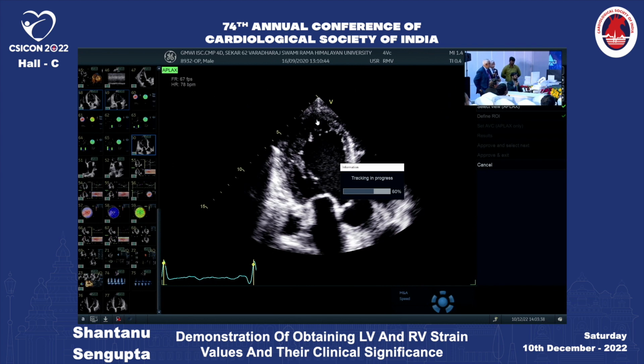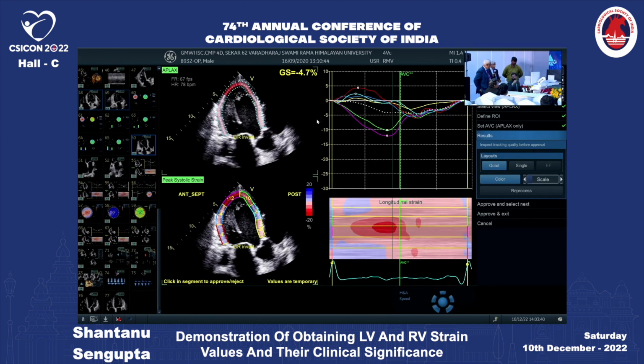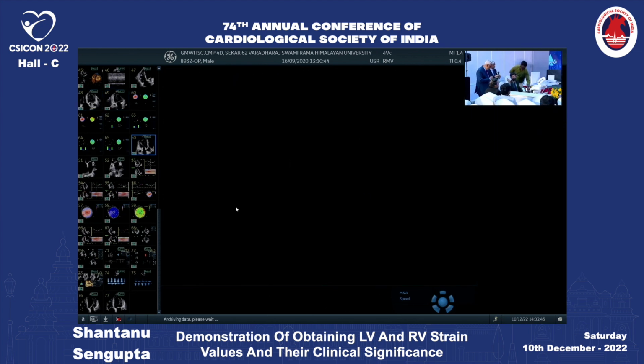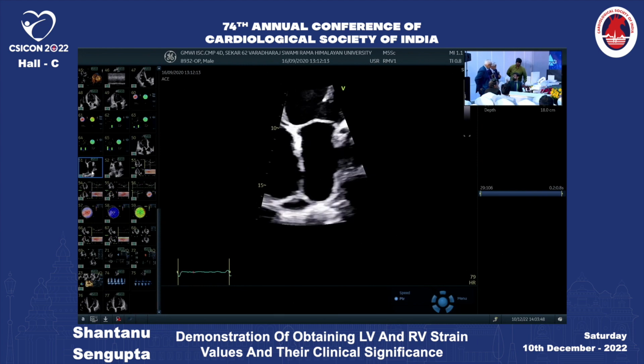Right? So do we have time for left atrium? I don't know what is next. Yes, it is another 12 minutes, I think. Oh, that's nice. So how many of you are doing LV strain? I want to add one point. He wants to add something. Please.